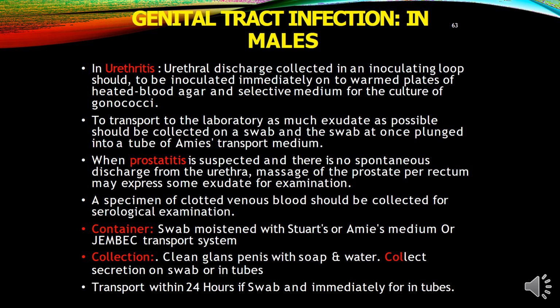Genital tract infections in males. In urethritis, urethral discharge is collected and should be inoculated immediately on warm plates of heated blood agar and selective media for culture of gonococci. To transport to the laboratory, as much exudate as possible should be collected on a swab, and the swab plunged into the Amies transport media.